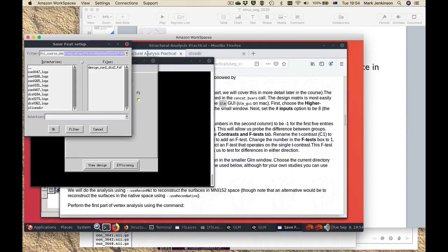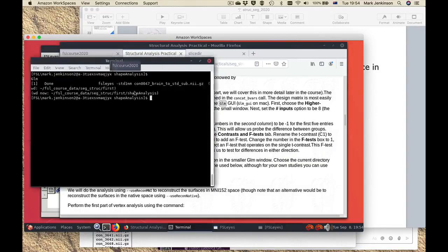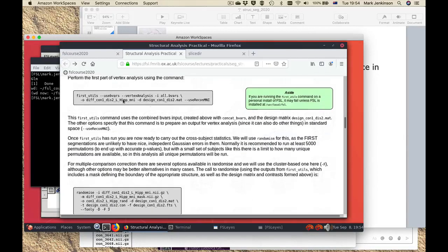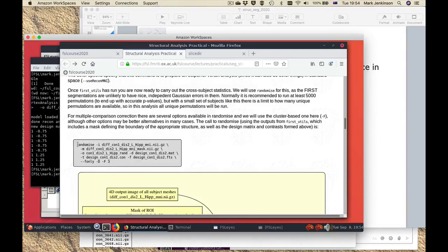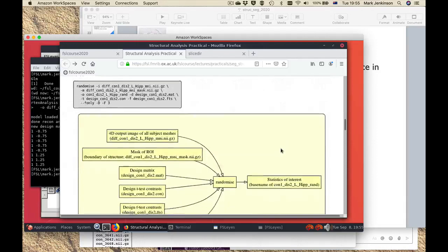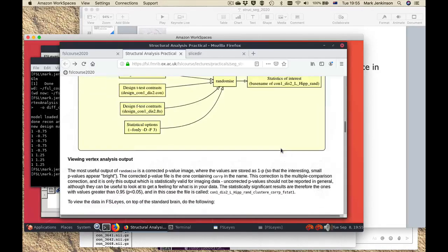Once you've set up that design you can check you get something like this when you do a view design, and then it's a question of saving that result. Make sure you're in the right directory and save it with the name that the practical asks for. I've now saved that design and that's enough to allow us to do the statistics. There's a simple command to run, and then we also have to run the statistics command which uses a tool called randomize — used for non-parametric statistics within FSL. It's used across all different types of analysis: structural, diffusion, and functional. It's a very general tool and these are things we will cover in great detail in other parts of the course.